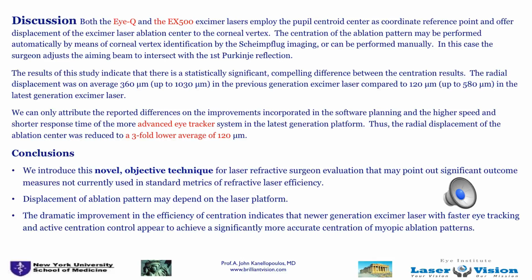So in conclusion, in this study we introduced a new objective technique away from what we have been used to seeing as far as visual outcomes, refraction, visual acuity, contrast sensitivity and wavefront data, that may help the refractive surgeon with new standard metrics in refractive laser efficacy and efficiency. The displacement of the ablation pattern may depend on the laser platform, and the dramatic improvement in the efficacy of centration shown here with the newer generation WaveLight laser has been attributed to the better eye tracking and shorter treatment time. Thank you very much.